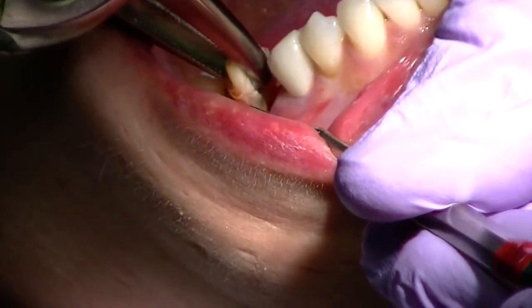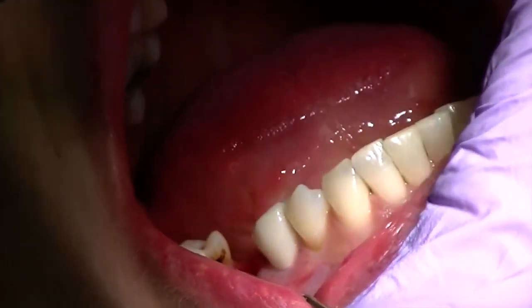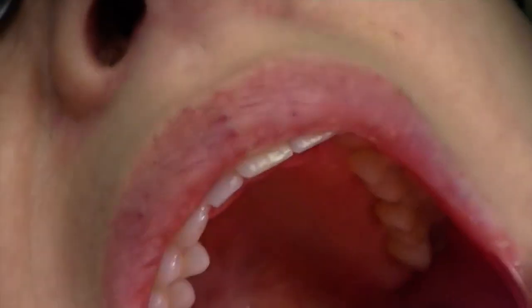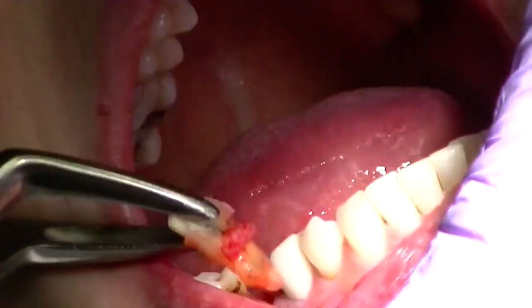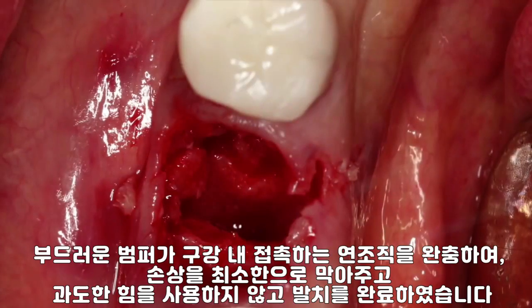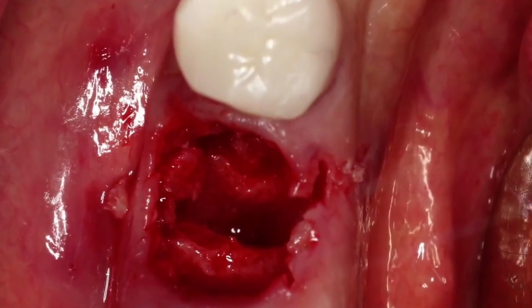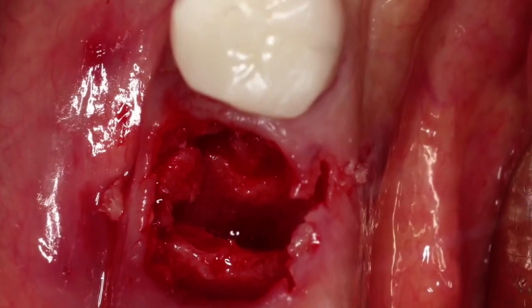Following extraction, there's granulation tissue on the mesial aspect of the tooth where the fracture line was. This is not bone. The tooth is removed atraumatically, maintaining the facial bone very, very nicely — an atraumatic extraction for the patient and an atraumatic extraction for the facial bone.